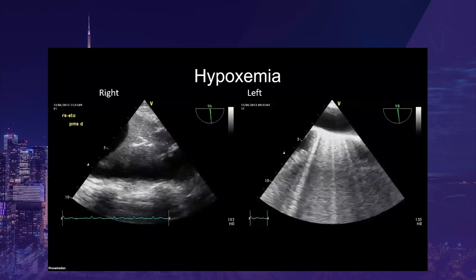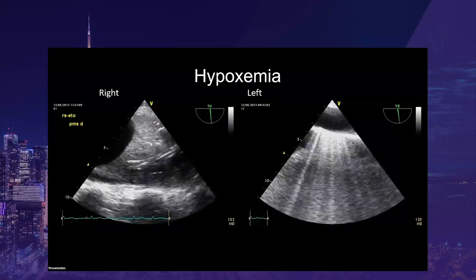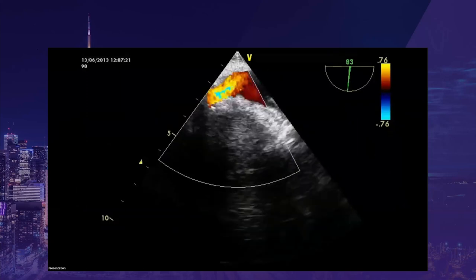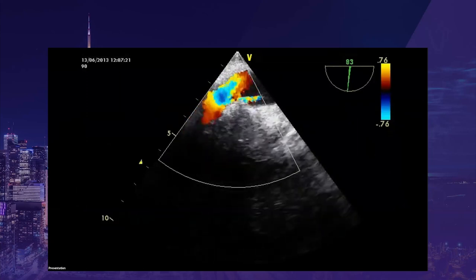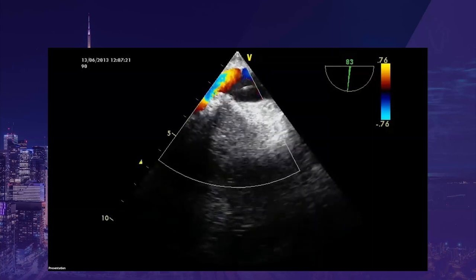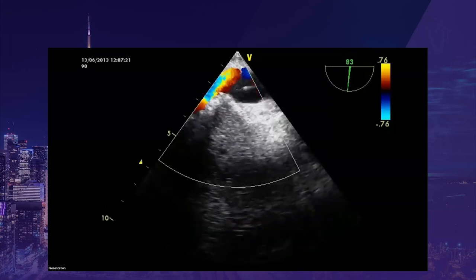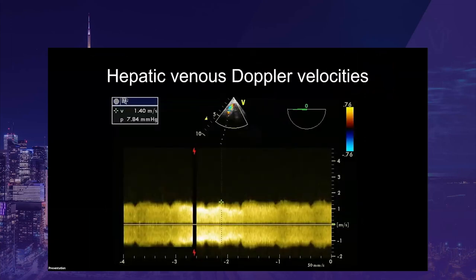One of the complications that can happen after liver transplantation is at the level of the inferior vena cava anastomosis. We go right to the anastomosis, and we see this obstruction — a high velocity signal at the level of the IVC anastomosis. As you put Doppler, you see a continuous abnormal signal. As I mentioned, if you have a normally pulsatile signal and it becomes continuous, that's abnormal. This is an abnormal hepatic venous Doppler signal.